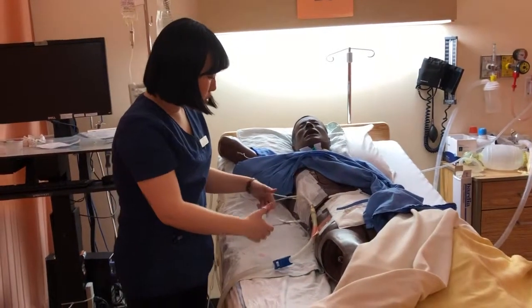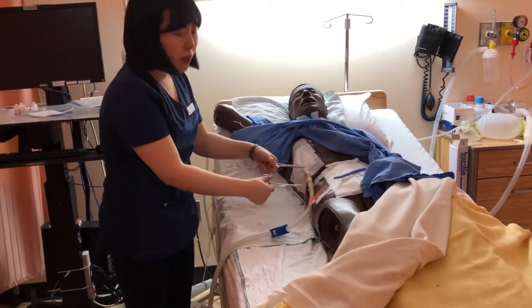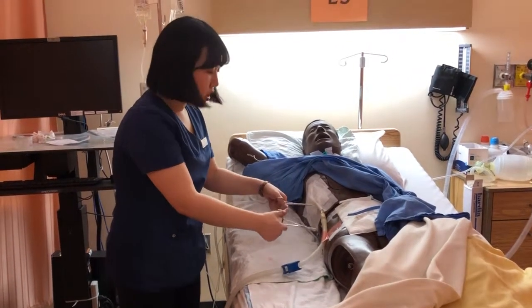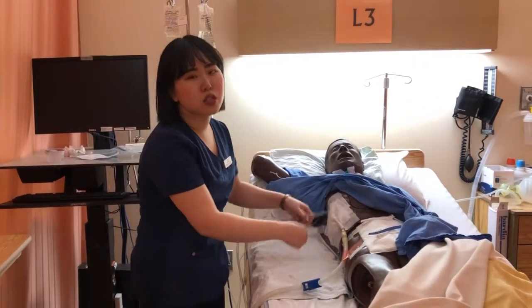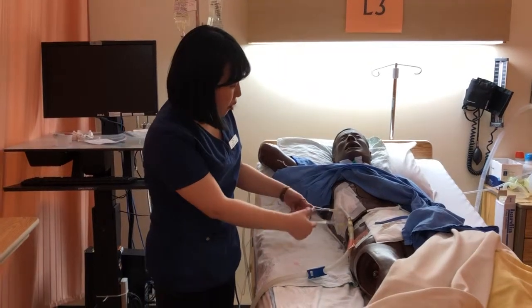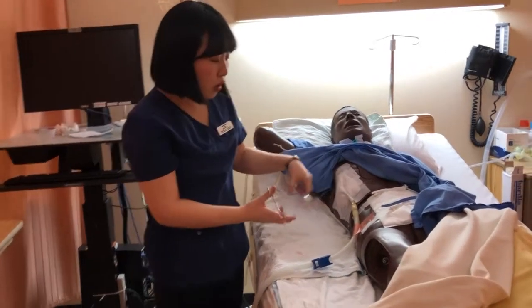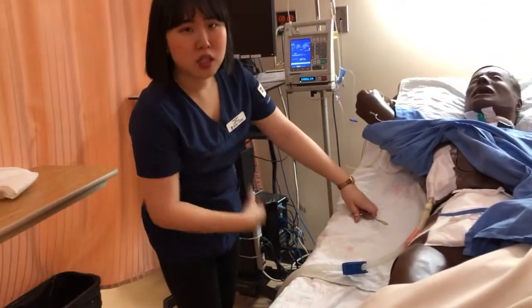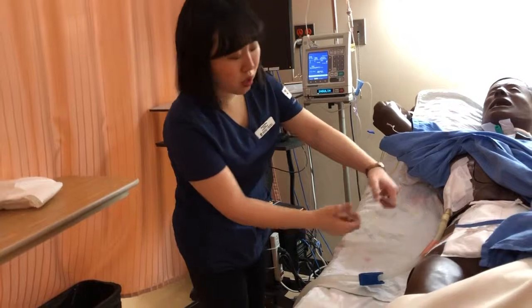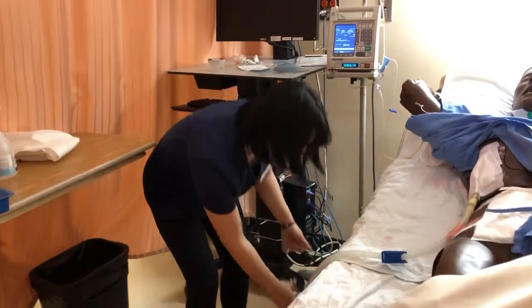But if you still see the bubbling, you're going to go next like this, and this is the connection side, which is also easy to leak. If the leak is here, then you're going to tape it with waterproof tape, and if the bubble is still bubbling, then you're going to go down and check where the leakage is from. Reapply the dressing.